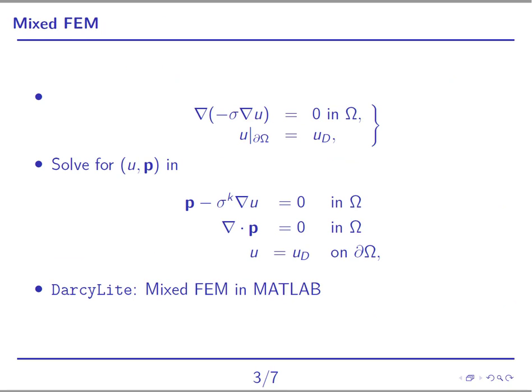To solve the governing equation for the electrical field, we are using the mixed finite element method, where the governing equation is split into a system of first order.